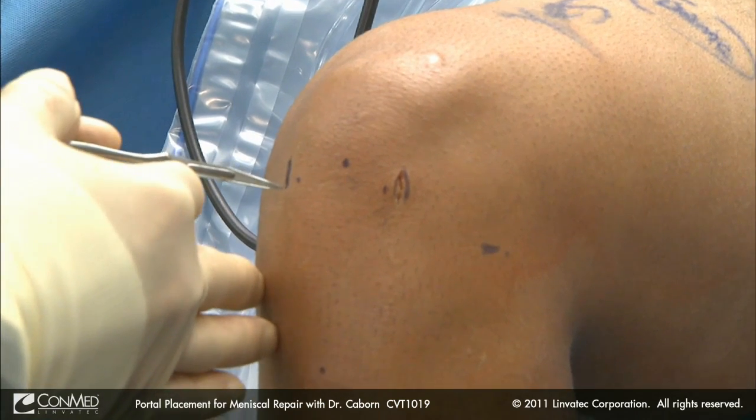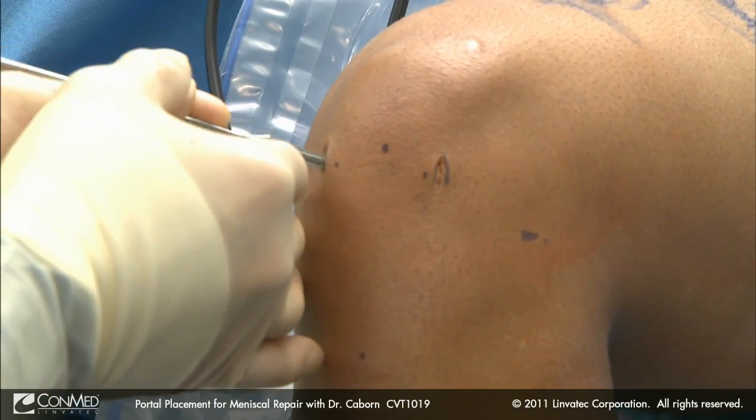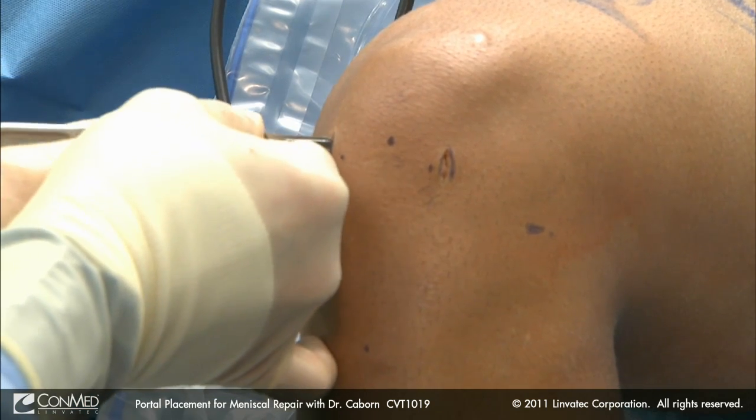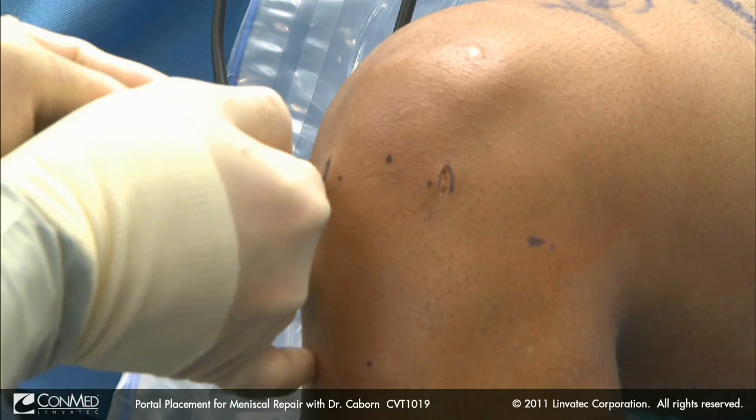And I come over to the medial side similarly. We will go in through the skin, feel the capsule, pop through the capsule, release the capsule superiorly, switch our knife over, and then just push down.